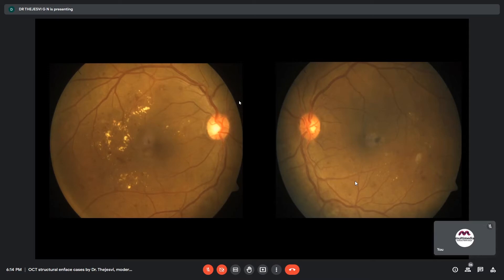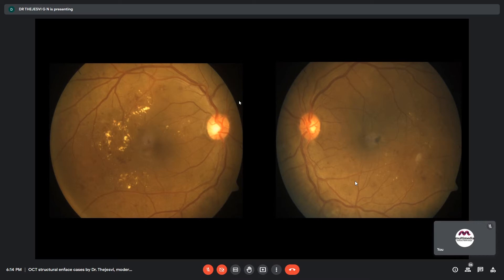The color fundus image of both eyes: the right eye shows clear media, a normal disc with healthy neuro-retinal rim, a few arteriovenous crossing changes with multiple hemorrhages and hard exudates — superior, inferior temporal to the macula — some arranged in a circinate pattern and few scattered. There is a sub-retinal grayish appearance or retinal whitening temporal to the fovea. The left eye also has AV crossing changes with multiple hemorrhages, fewer hard exudates, a few cotton-wool spots, and retinal whitening with a pigment plaque temporal to the fovea.